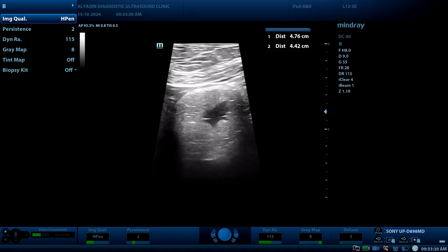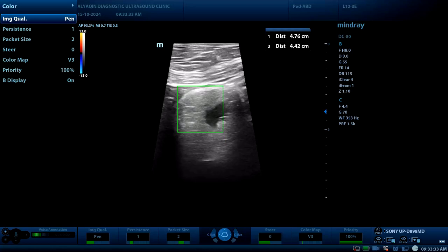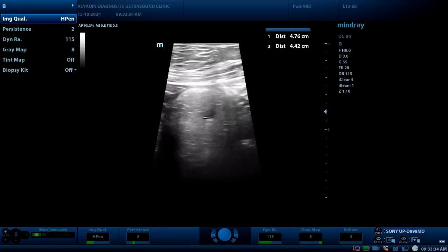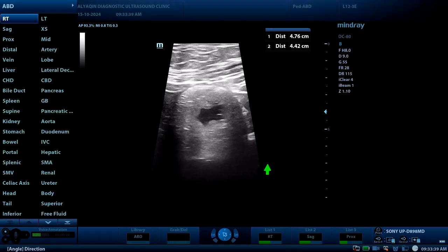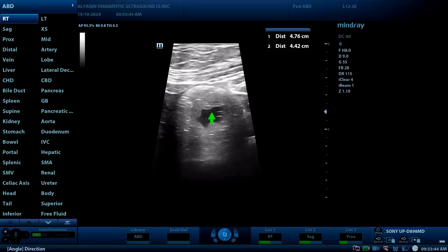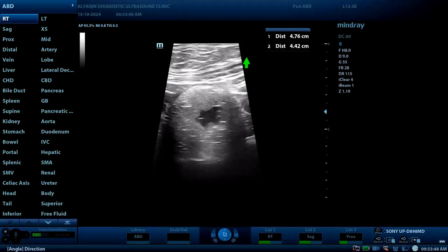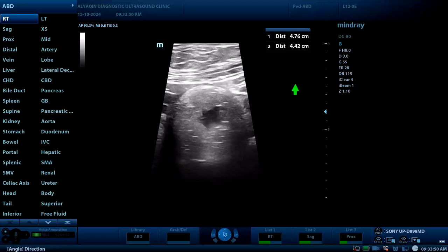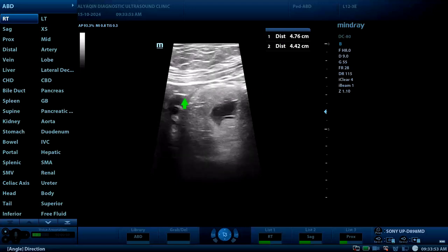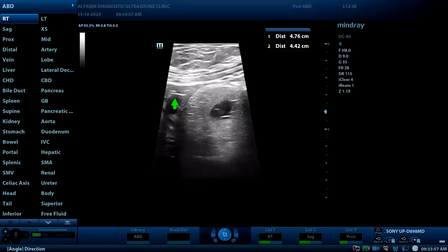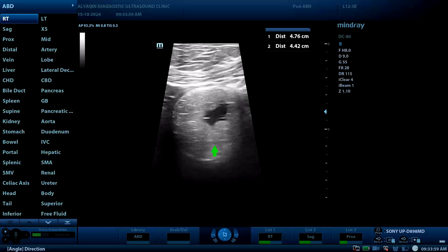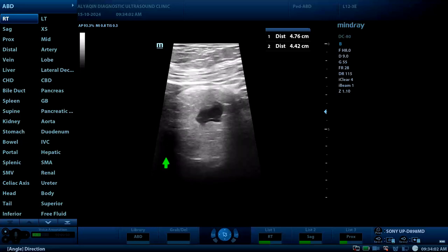Welcome, new case. I'm using the linear probe, high frequency. Poor vascularity of this lesion. The lesion has a smooth outline, round shape, and contains a central cystic fluid-filled cavity. Size is 4.75 by 4.4 cm. Healthy stroma of the right ovary — so the mass is related to the ovary itself.